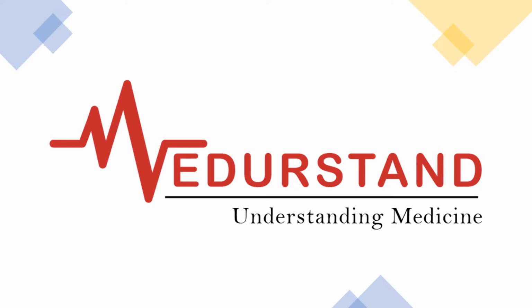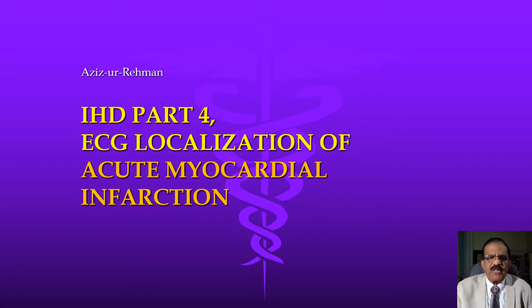Understanding Medicine. I am Professor Aziz-ur-Rehman, and we have already discussed various aspects of ischemic heart disease, and this is the fourth and the final lecture in this series. And today we're going to talk about ECG localization of acute myocardial infarction.